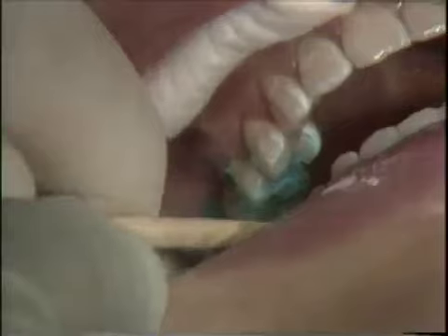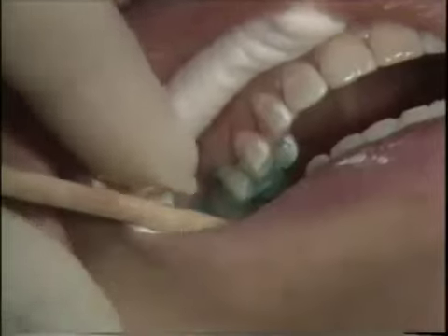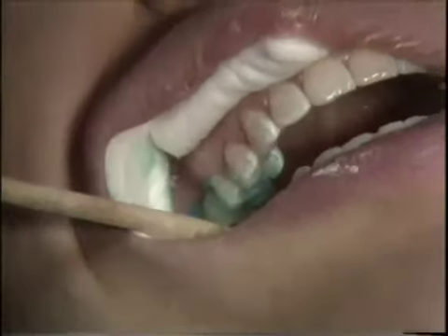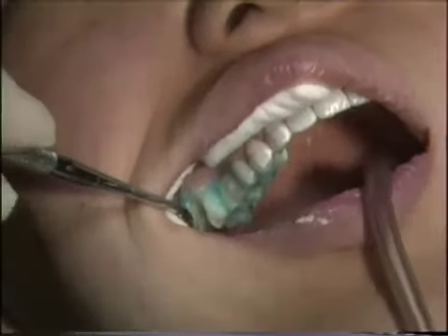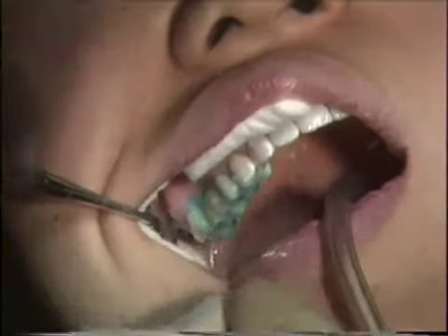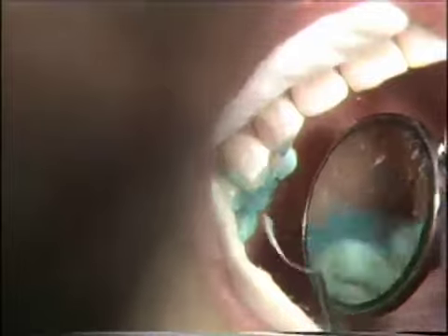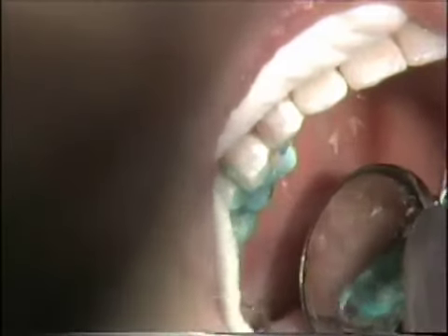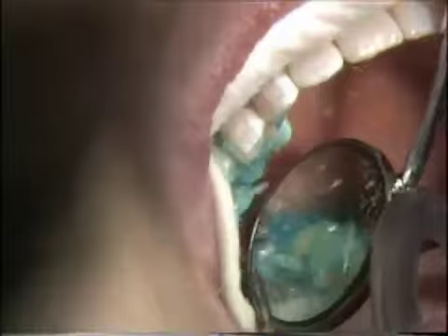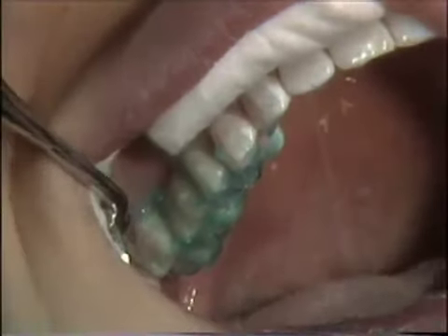Okay, can you close please? Okay, now open again, now close again. Have her just close with pressure like that until the cement is set up. Ten minutes has gone by and the cement is still fluid on the mixing pad. However, the cement in the mouth under the OxyGuard has set up. Now we are going to remove the excess OxyGuard — the wax — and then remove some of the cement.